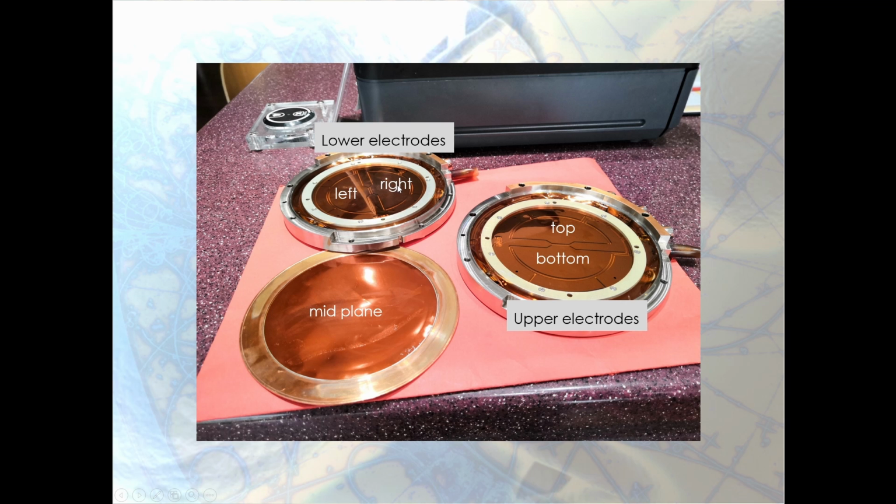And as a matter of fact, the double chamber is created when you assemble all those 3 parts. You leave this one on the lower part, you put this one on the top of it, you reverse this one and you cover it, and then you've got your chamber. And there you've got some device to connect to air, because it's an air vented chamber, and you have electrodes, so you've got also some electrical wires, which we don't see here.